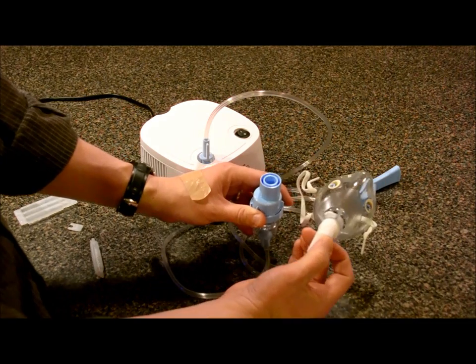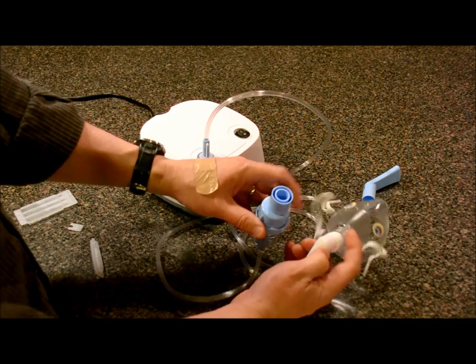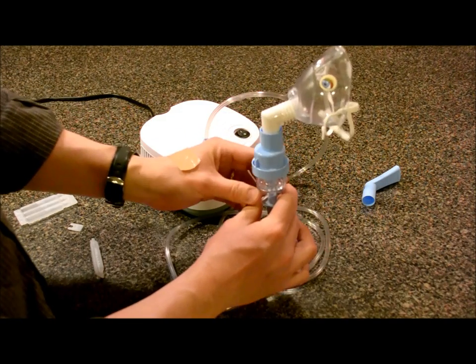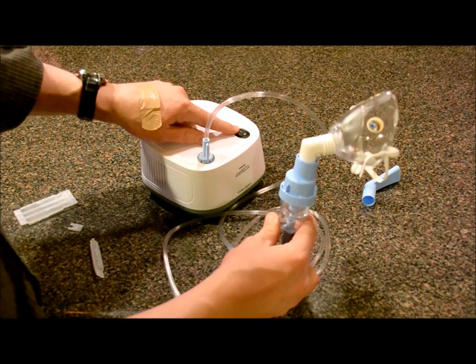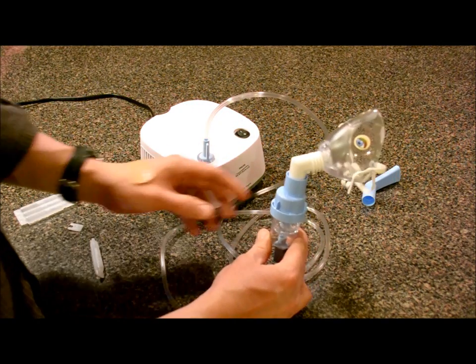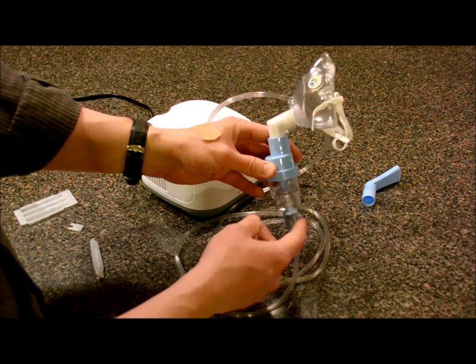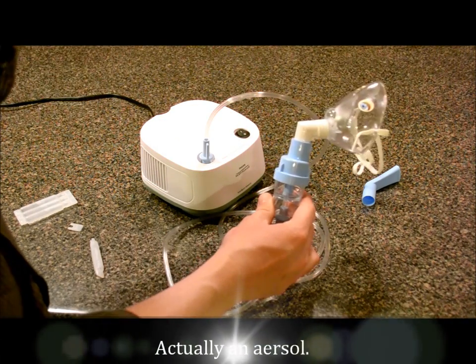Or for the little kids, they have a little face mask — this one is actually called Sammy the Seal. The kids actually put little eyeballs on it. You put that on them, have the little kid hold it there, and just flip the machine on. It'll buzz for about two or three minutes and nebulize the liquid into a vapor that they can inhale and get their medicine that way.